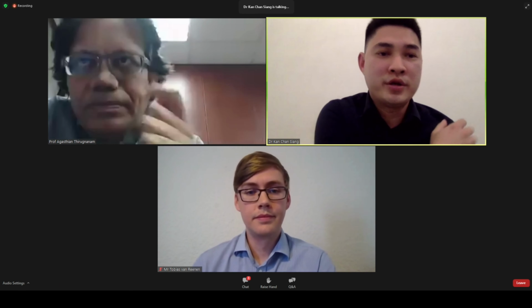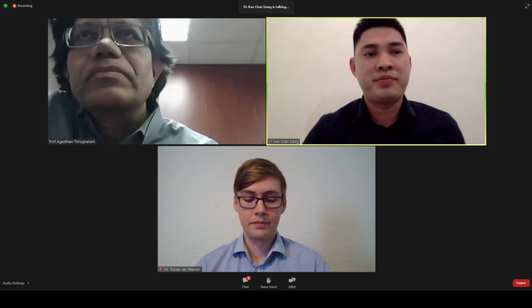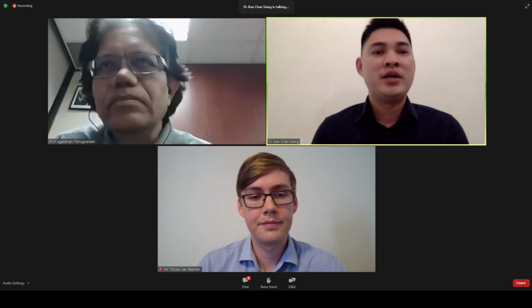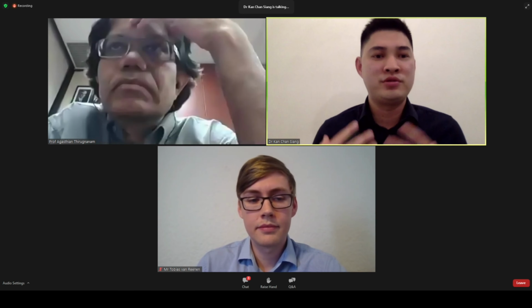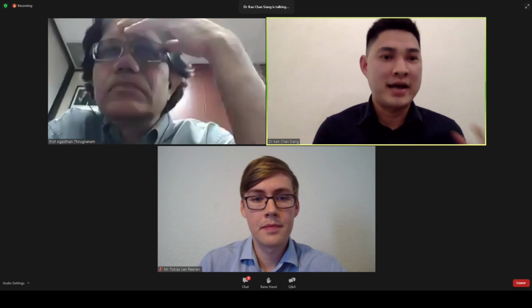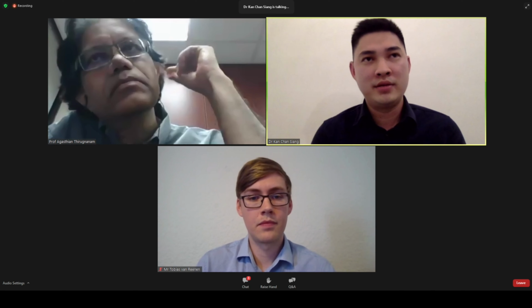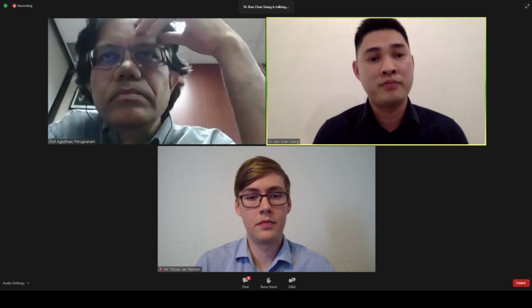Yeah, that's a good question, Prof. In my opinion, if there's a presence of bronchopleural fistula, especially with an extensive air leak, by applying pressure you get what we call the steal phenomenon, which means you're stealing the air from the patient's tidal volume. So in my opinion, I wouldn't put negative suction in patients with a confirmed case of a bronchopleural fistula.